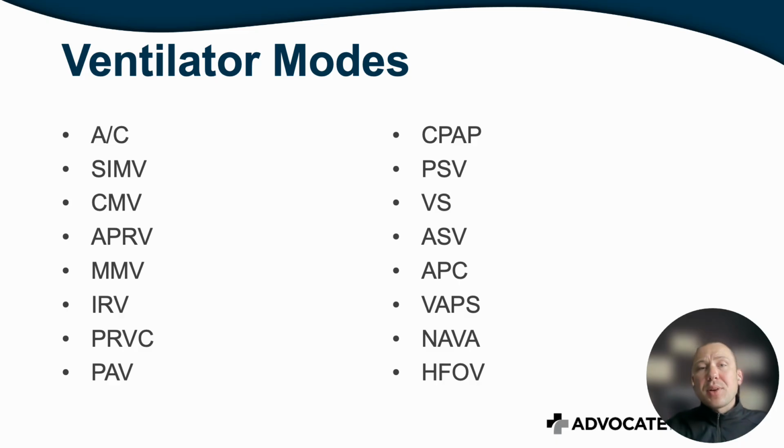So here are some names of the common ventilator modes that you might have seen on your mechanical ventilator: volume assist control, SIMV, etc. So how do we use that equation of motion, and how can it help us name those modes in a common nomenclature?